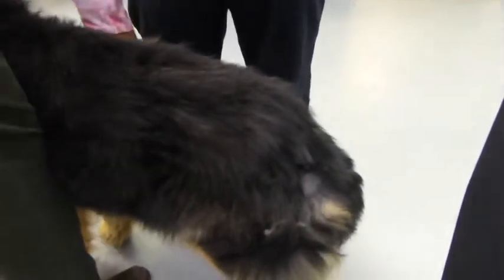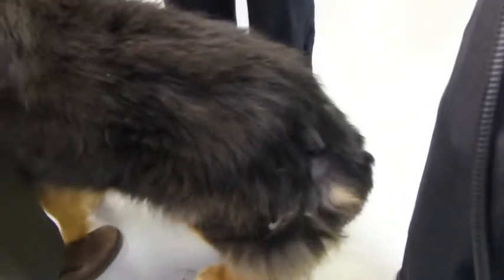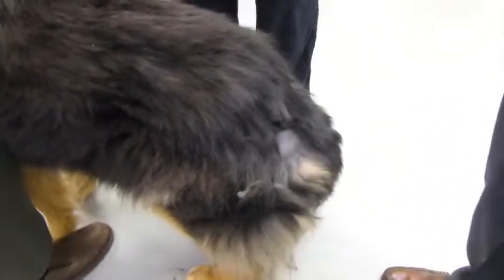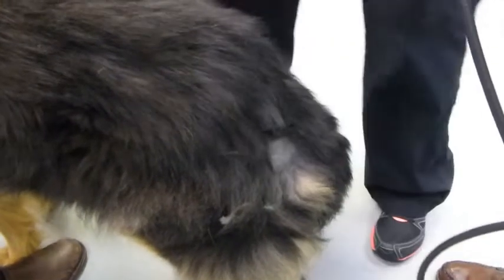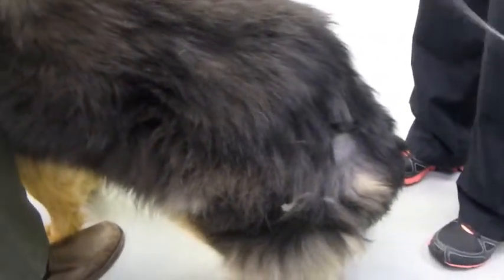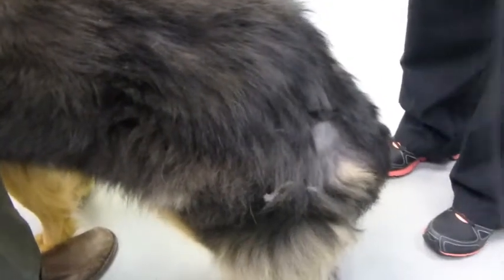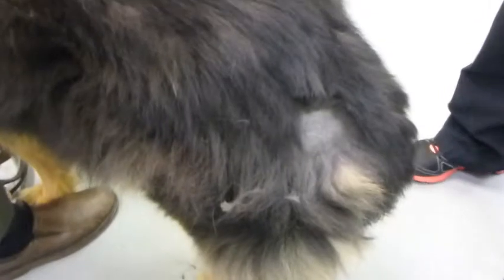Put it on the probe — you can put it on either one. I'm going to hand it to one of you, make sure you have a good grip on it. For the sake of ease, I'll control the shocks and I'll control the energy. All you do is administer.